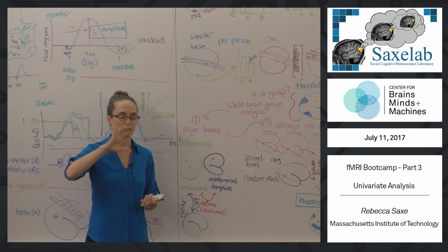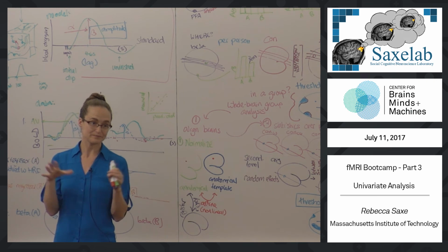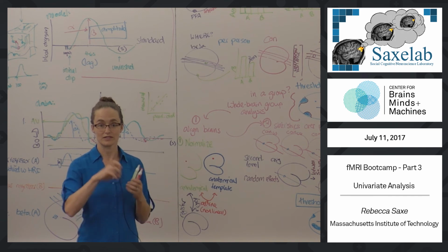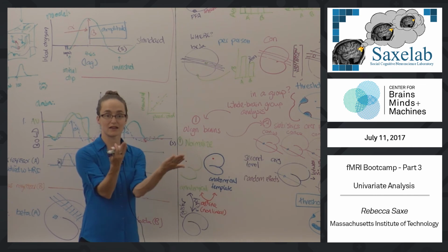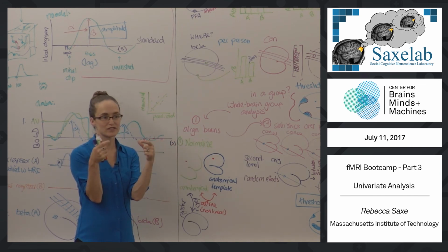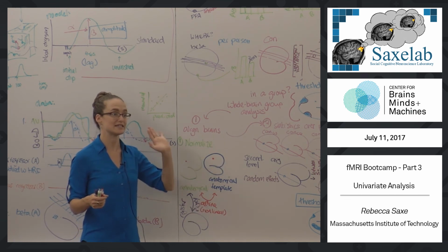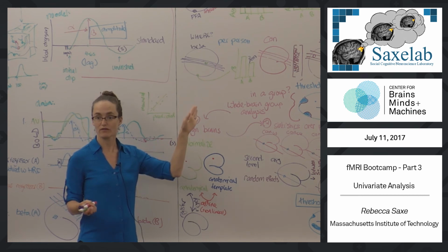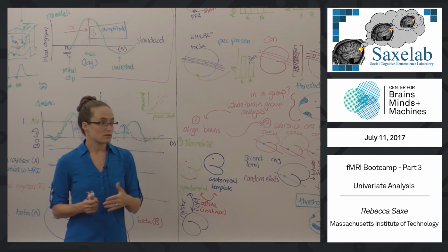How do we know this? If you take, for example, a brain that's dead, map all of its functional regions, for example, based on cytoarchitecture, so its anatomically defined areas, and then you do this process to it, and look at how it aligns to another dead brain, the answer is, for example, that V1 only overlaps about 40% when you do it this way. And V1 is the easiest, best thing to find. So once you're in V2, it's like 20%, and for higher order regions, you can get almost no overlap at all using this procedure. So we know for sure.